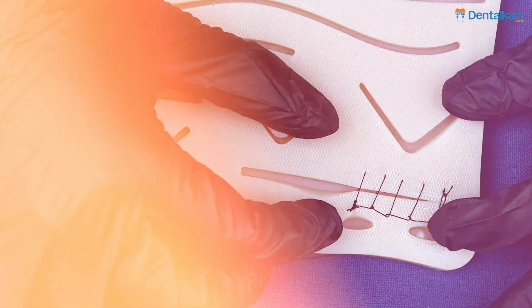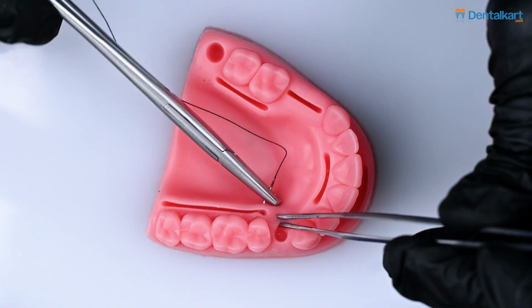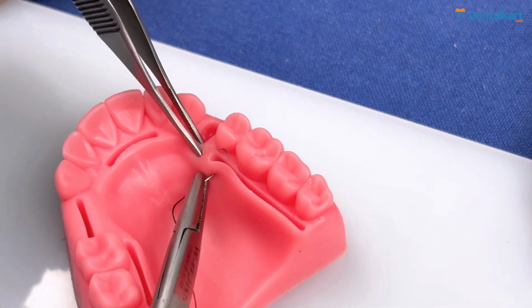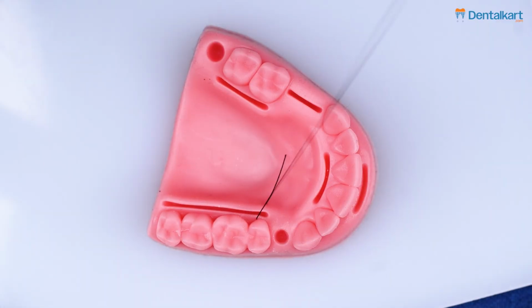Now, here we have a palatal long wound area. To practice the continuous locked suturing, we are using a 4-0 suture material instead of a 3-0 suture material because we would like to show more precision.